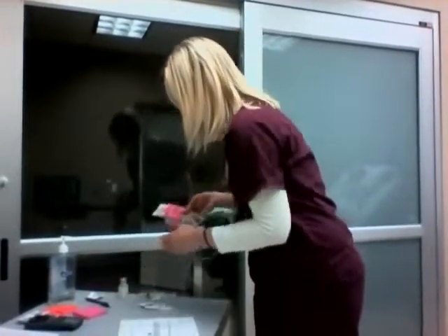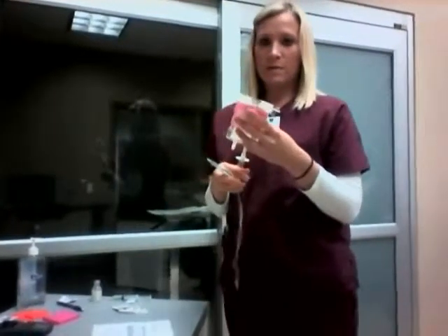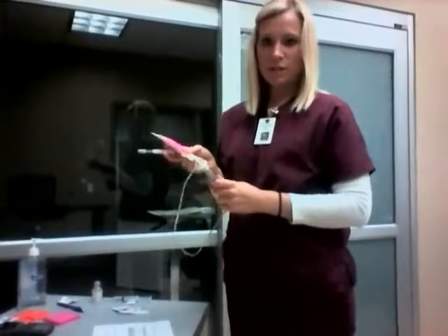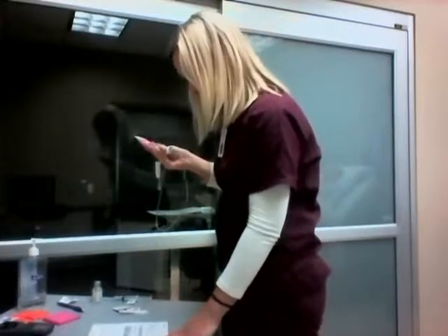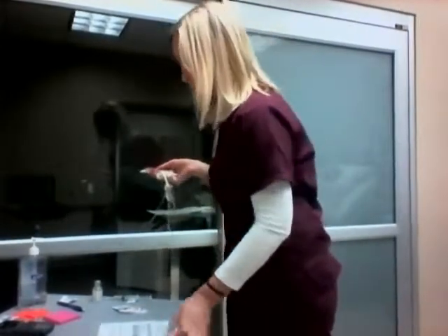And I'm back at the nurse's station. I'm going to make sure that, this is when I would probably spike my bag. I would get everything prepared. And then I would also check again to see that I have the right medication for the right patient at the right time and the right route. Also probably inspect the bag, make sure there's nothing floating in there. So now I'm going to find my second RN so that she can come into the room with me and check this before I start the infusion on the patient.